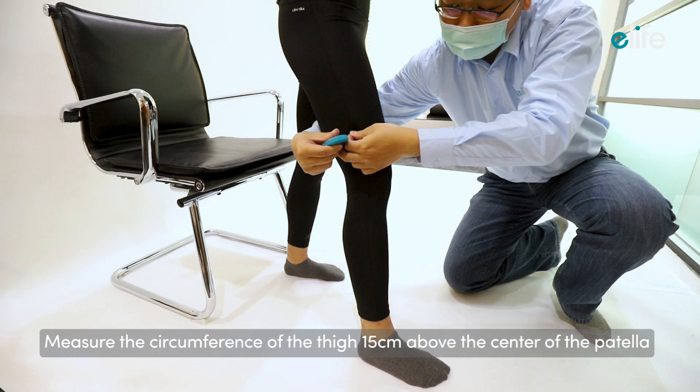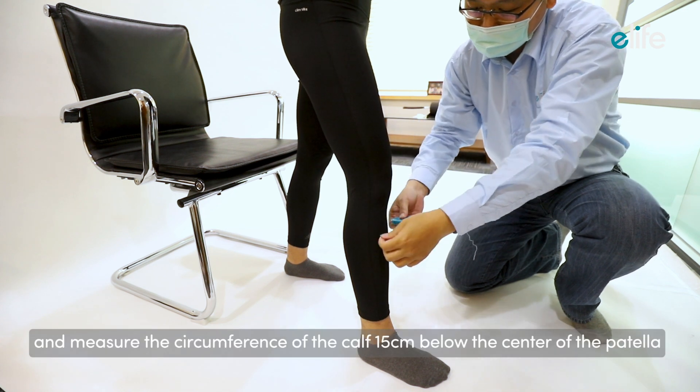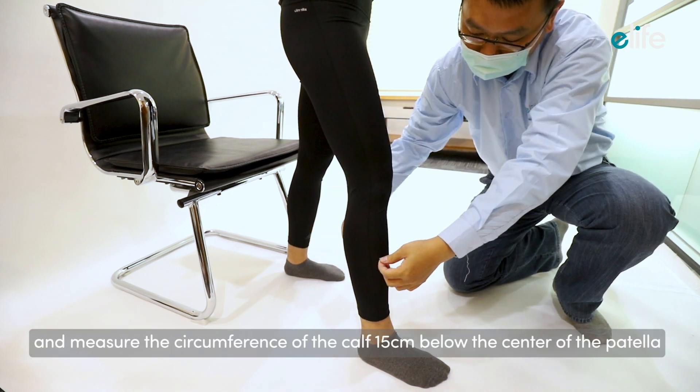Measure the circumference of the thigh 15 centimeters above the center of the patella, and measure the circumference of the calf 15 centimeters below the center of the patella.